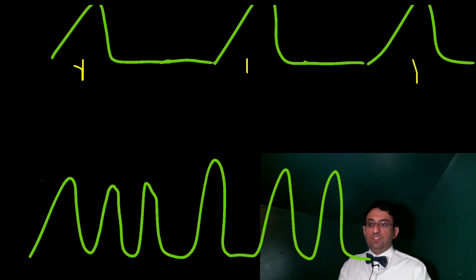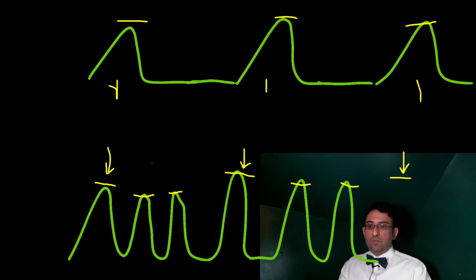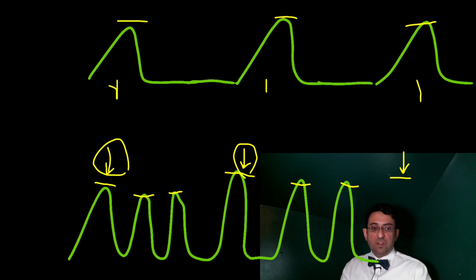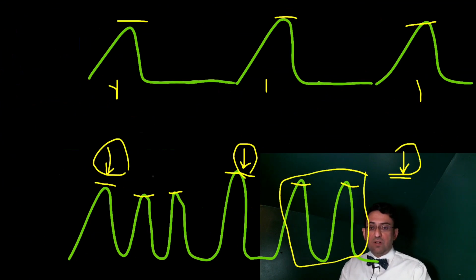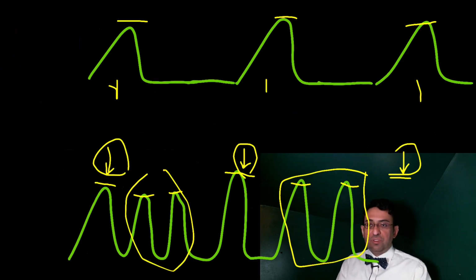On the other side, you may see a patient whose mechanical ventilation waves look like this. We have some peaks of equal amplitude at regular intervals, but in between them we have some weaker peaks, and that indicates that the patient is also breathing. These arrows are the moments where the ventilator provides the respiration, but the ones in between, which are usually more irregular or weaker, are the patient's breathing. This means the patient has some control. And this is an example of synchronized intermittent ventilation.